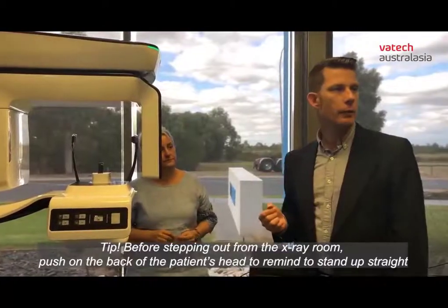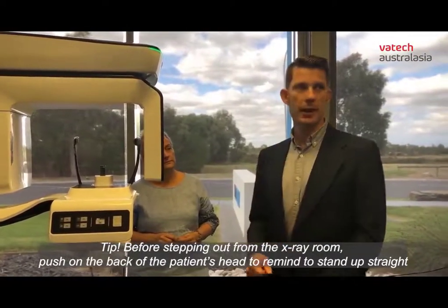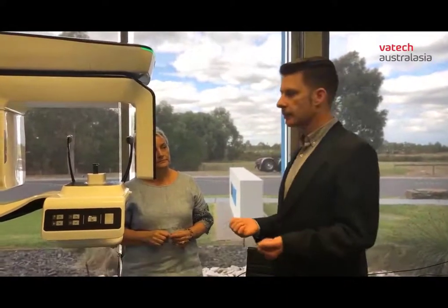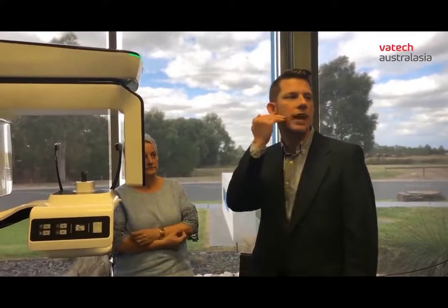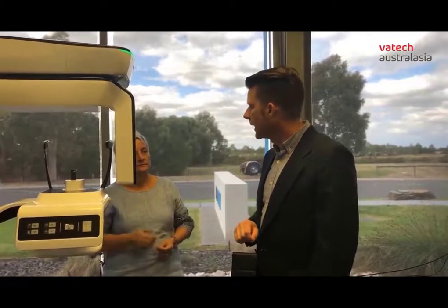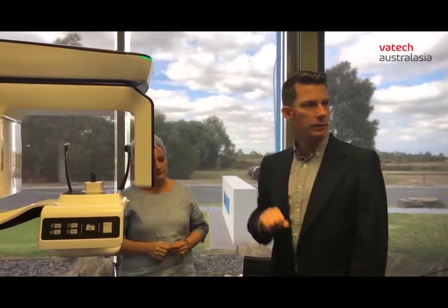Right before I step out of the room, I usually push up on the back of the patient's head and then walk out, and it just reminds them to stand up straight and tall. Otherwise, what they'll do is, while you're outside, they'll go like this. Right, and now we have a flat occlusion. Our spine's collapsed, and we're going to get the white spinal shadowing. So that last little bit of pushing up on the back of the head is definitely going to give us more of that smile.